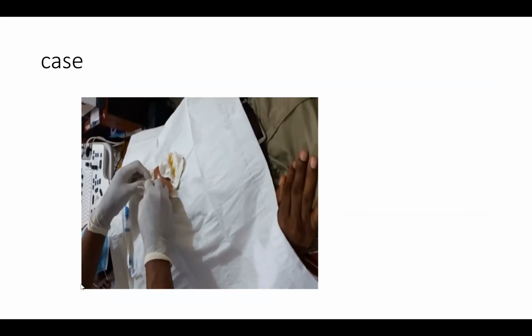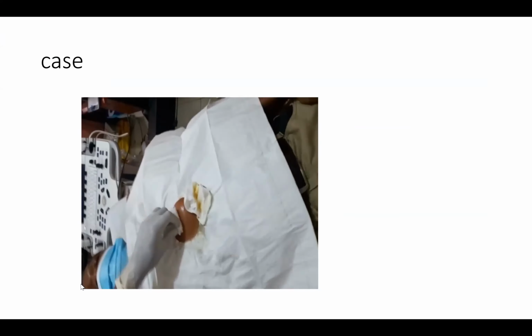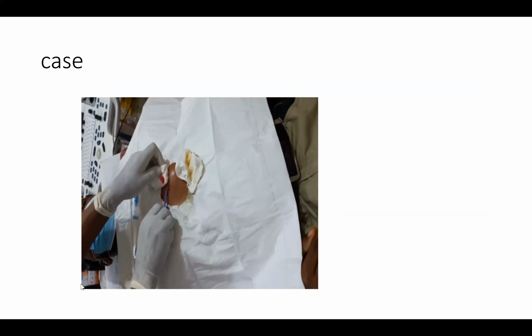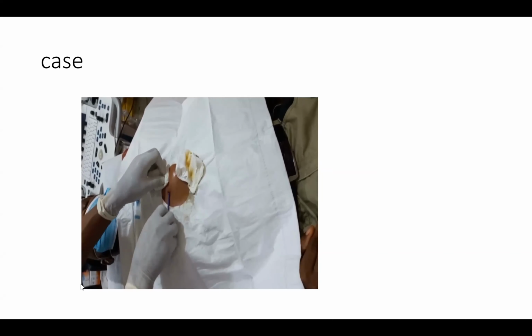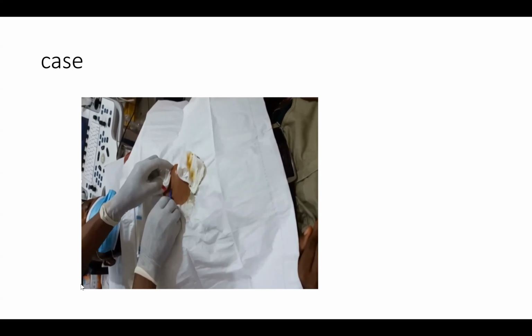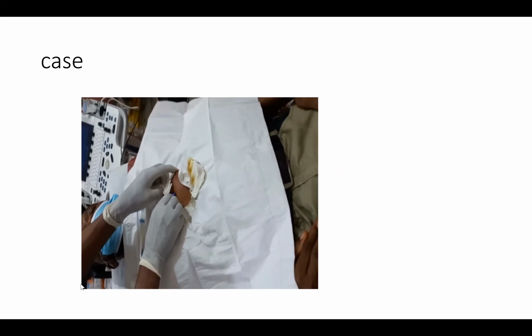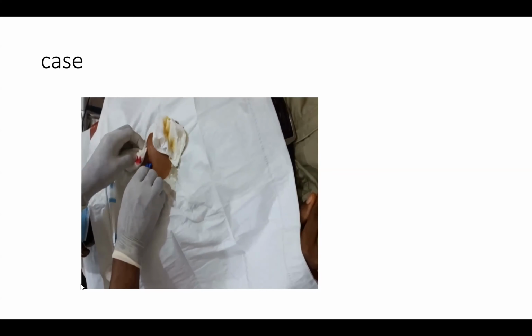Yeah, so this is a loop recorder. We implant it a lot here in Nigeria. As Dr. Chris said, we don't have the remote monitor. So what we do is we ask the patient that when there is a symptom, you quickly report immediately. That is the way we get the monitoring done in the absence of a remote monitor. We are working on it. We hope we will get it very soon.